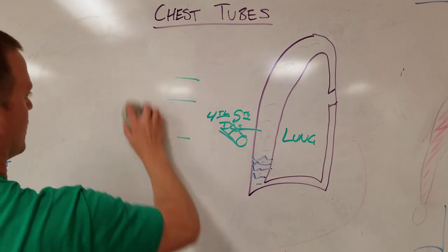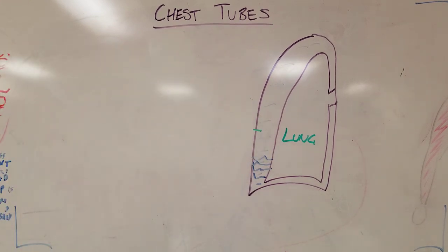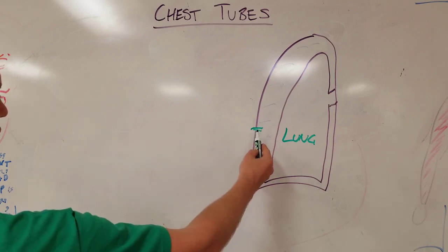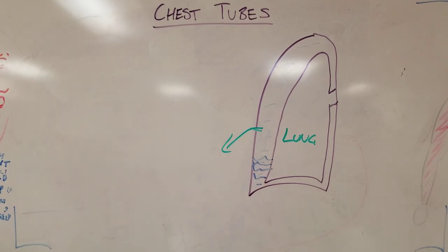When you get to that pleura, this parietal pleura actually has a pretty good strength to it. And so when you pop in, a lot of people have a satisfying pop when they pop in the pleura. If you're watching someone do it, you know when they get in the chest because when that person spreads to create their entry opening, you'll see fluid and blood and air, you'll hear air come out, and that tells you, hey, I'm in the right spot.